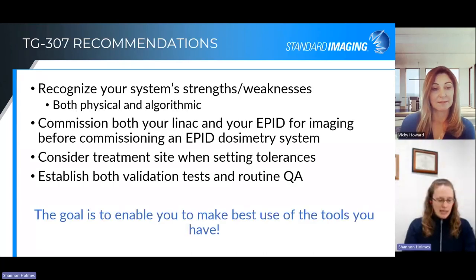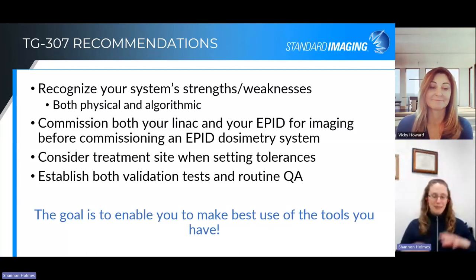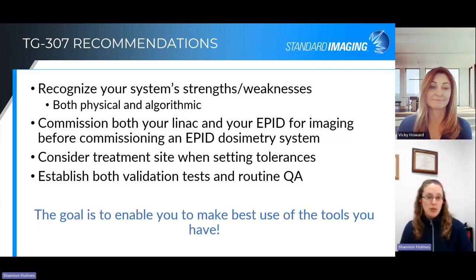So with that, I guess we're nearly at the end of our half an hour. I don't like to take up huge amounts of your time. I know this TG307 is a very large work. We've given the umbrella overview of it, and I'll go through these final recommendations that it has. But I do strongly recommend that you read through it to get the details.